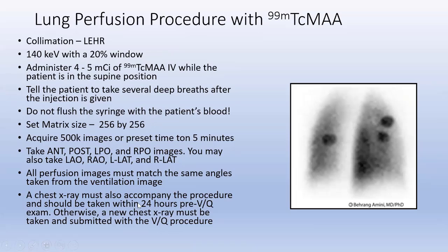As far as a chest x-ray is concerned, you want to have a chest x-ray either right after they've had the ventilation perfusion lung scan, or right before, but you go up to 24 hours prior to the lung scan. After that, usually an additional chest x-ray is required. And the chest x-ray will also help us identify whether or not there are some other defects, like infiltrates into the lungs, which would probably appear as a matched defect in your ventilation perfusion lung scan.